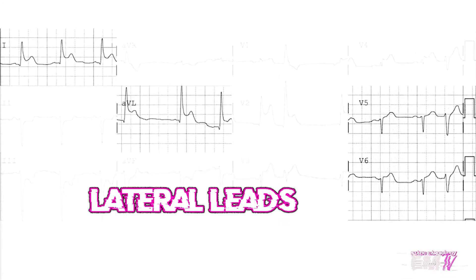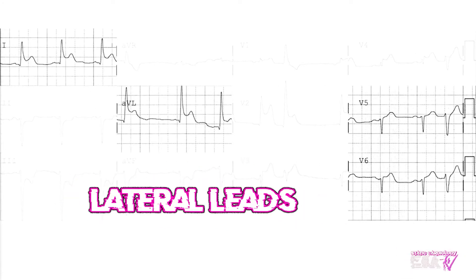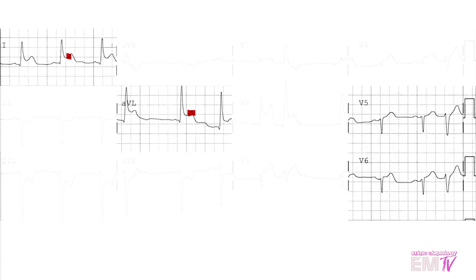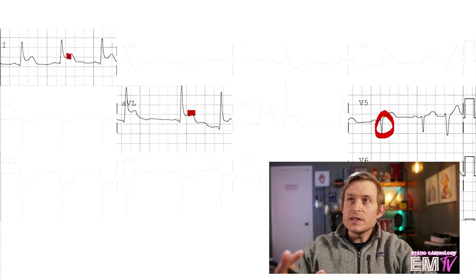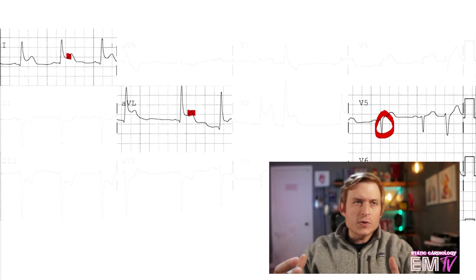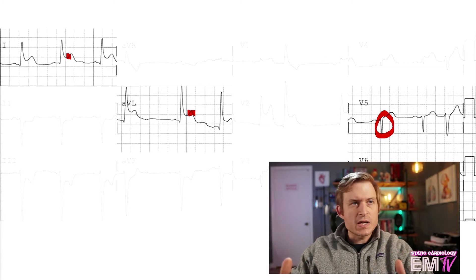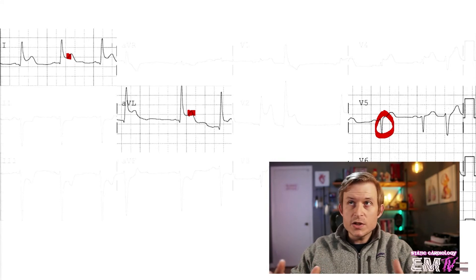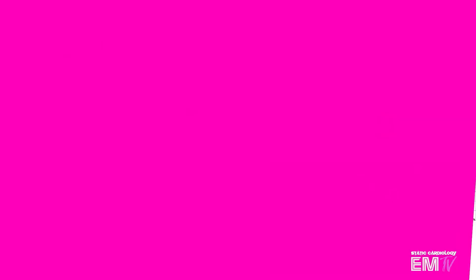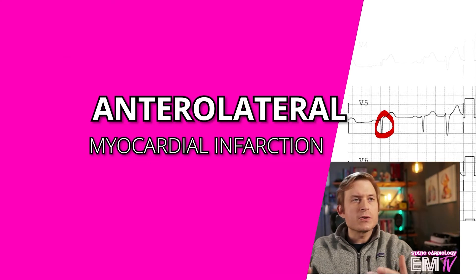In my lateral lead grouping, I'm seeing significant ST segment elevation in leads 1, AVL, and then possibly V6, though that may be on the fence. In V5, it looks like it's not quite enough to make that determination. However, in order to make a positive identification of a STEMI, you need at least two leads within an anatomically contiguous lead grouping to be elevated. Knowing that, I am seeing lateral involvement here. It's more significant in the anterior leads, but I would diagnose this as an anterolateral STEMI or an anterolateral MI.